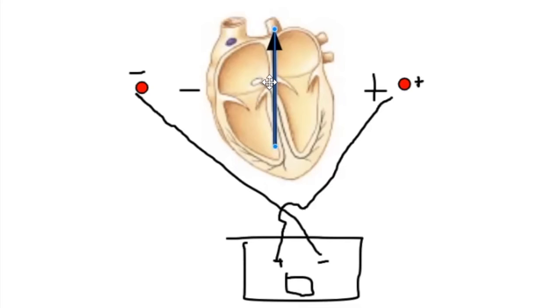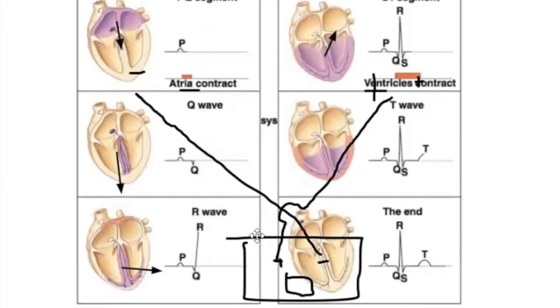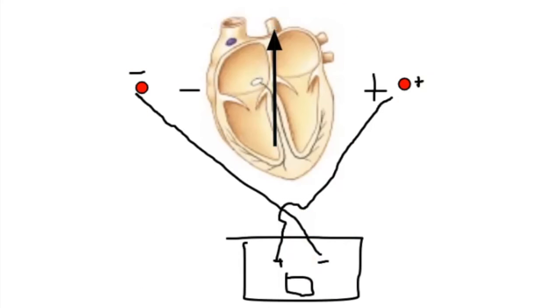Okay. So, do you think then, given that we walked through all these different vectors for the activation of the heart in this simple case, do you think 2 electrodes is enough? How many electrodes do you think we would need? Depends on what you're trying to find. Explain.